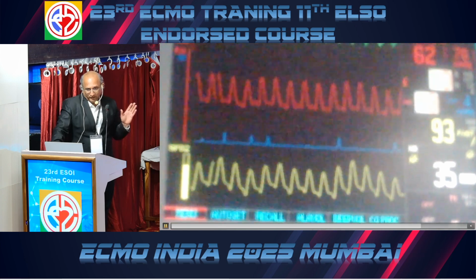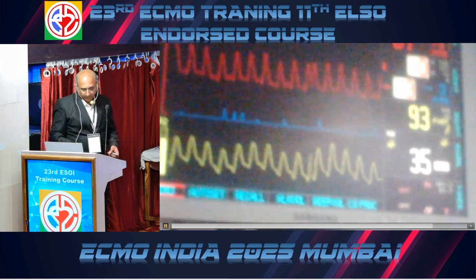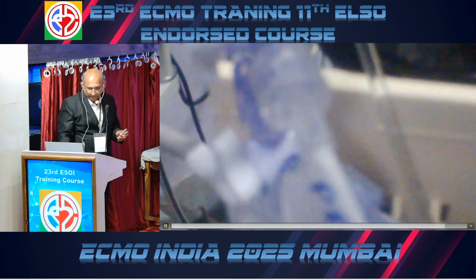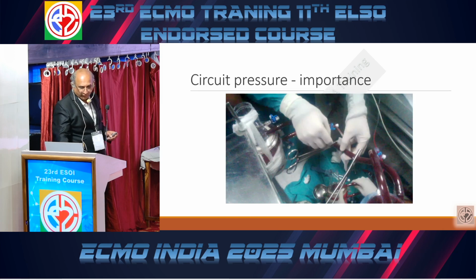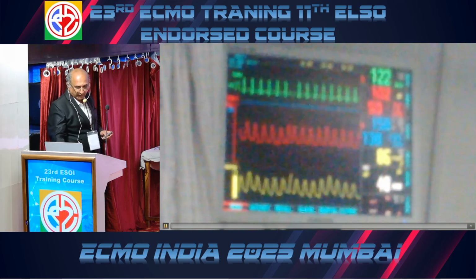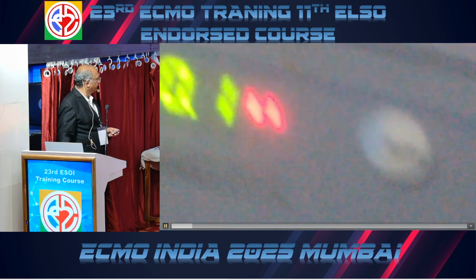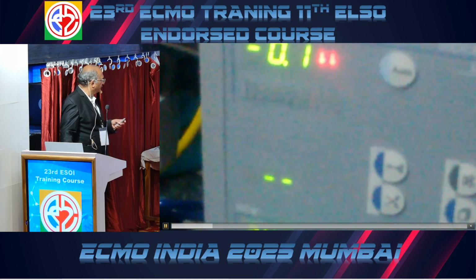And this is the pre-pump pressure, -4. Saturation was 93 with that flow. So he was maintaining, and we tried to avoid changing the oxygenator. But then he started developing some hemolysis. So in that case, we thought we have no other choice, we have to change the oxygenator. This is the step we are showing you now, the change of oxygenator.